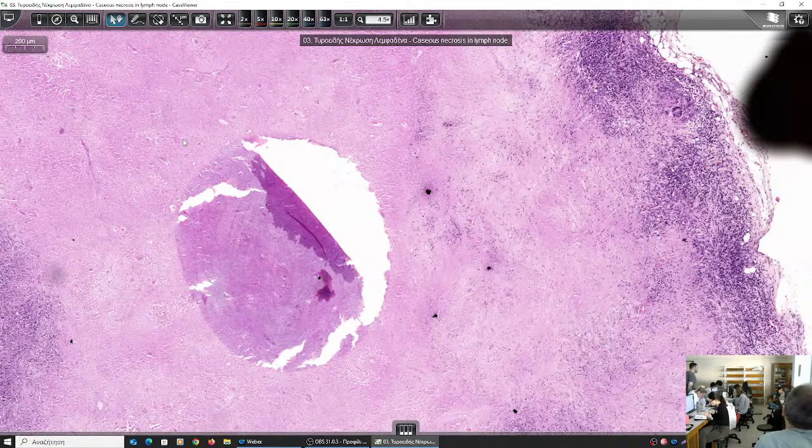This might be an immunocompromised patient, and he would not have enough lymphocytes to produce the lymphokines and make the granulomas. That's why in immunocompromised patients, we just have the necrosis without the formation of granulomas, because in order for granulomas to form, you need the immune system. If the patient is immunosuppressed, he won't have the lymphocytes to produce the lymphokines that will tell the macrophage to be only secretory cells and have the epithelioid transformation and form the granulomas. So in that case, you just have the hypersensitivity reaction, which is, in the present case, caseous necrosis.